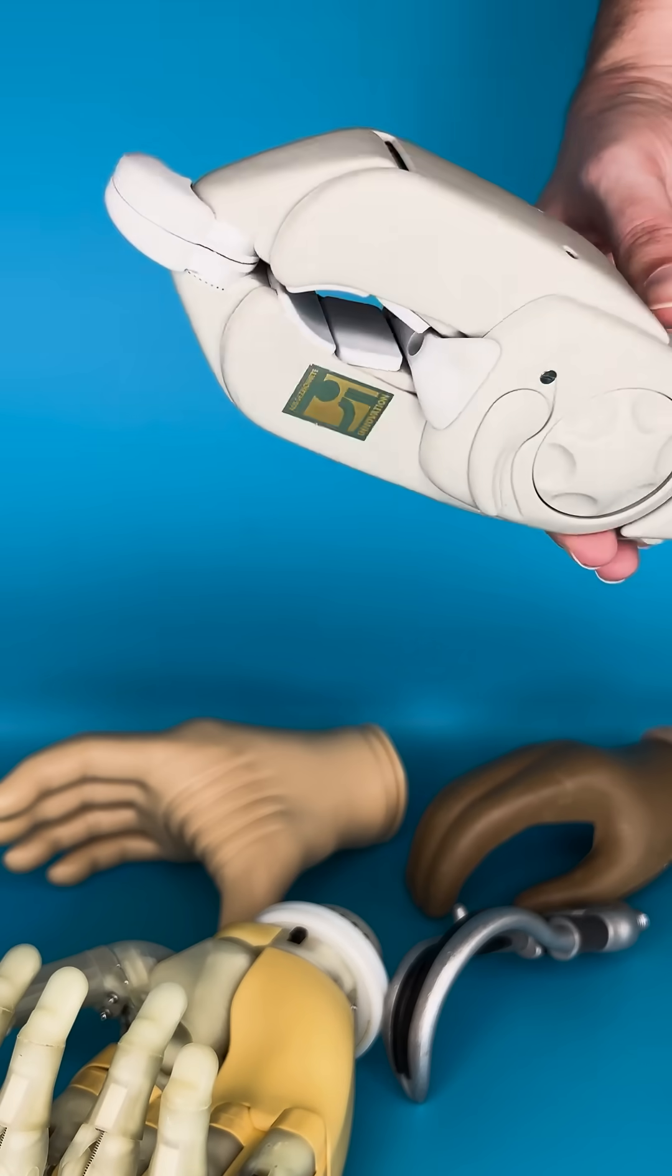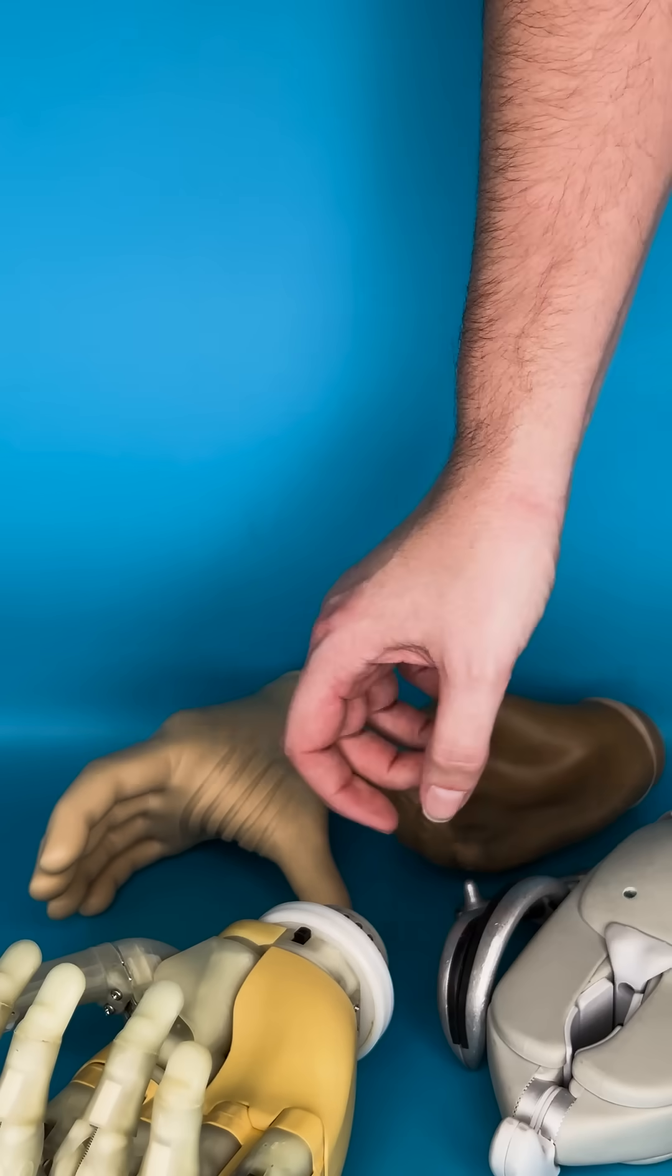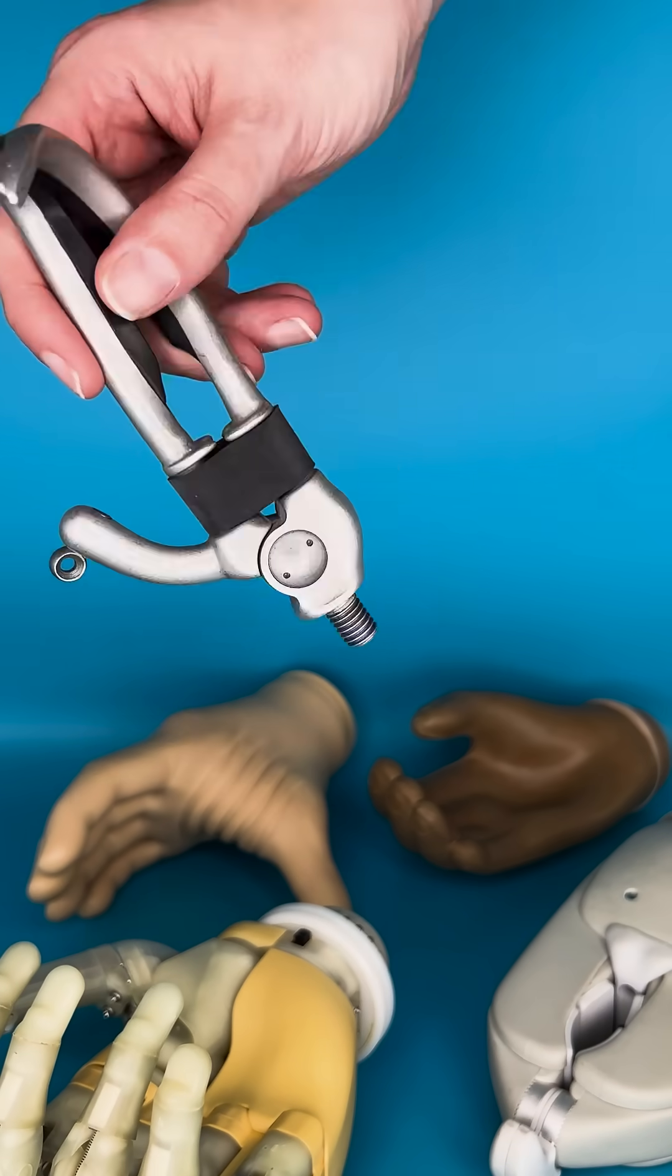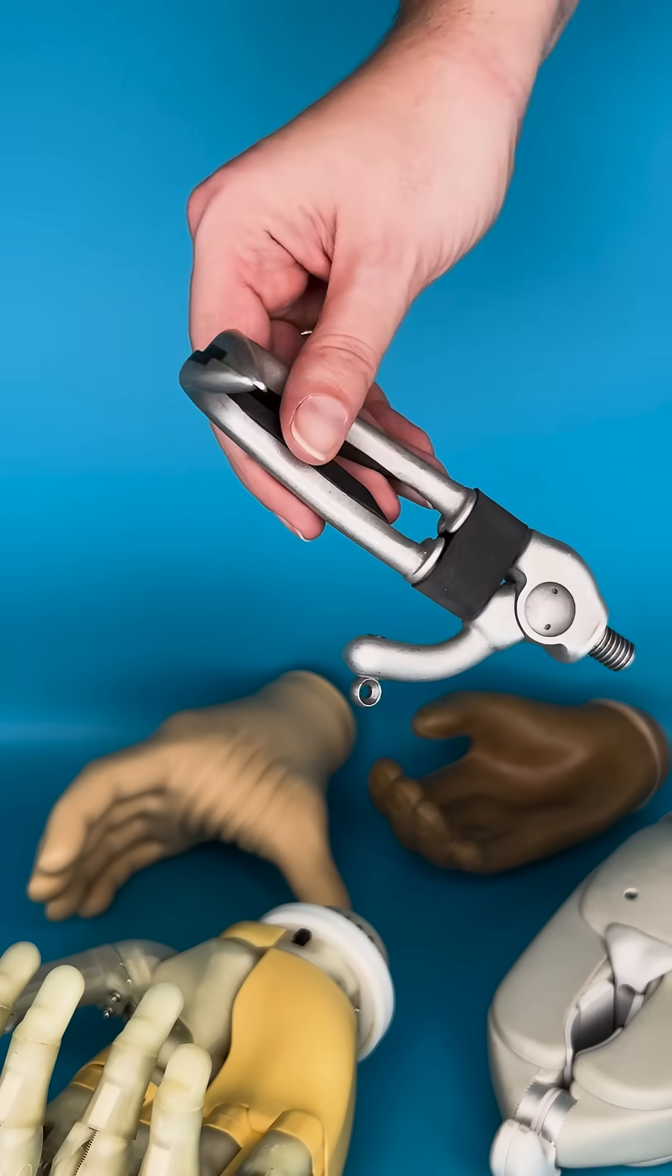For people looking for function we have what we call active prostheses. These tend to be less aesthetic but they can open and close, allowing you to pick up and manipulate objects.